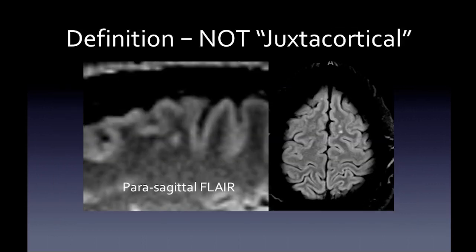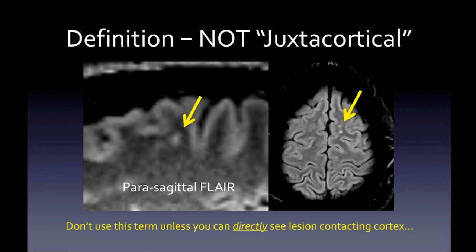Here is an example of what is not a juxtacortical lesion — these are subcortical lesions. Don't use the term juxtacortical unless you can directly see the lesion contacting the cortex. Subcortical lesions would not be specific for multiple sclerosis.